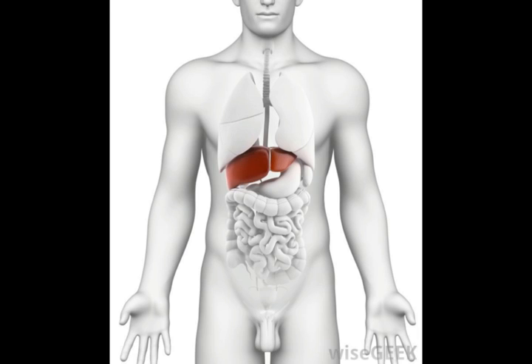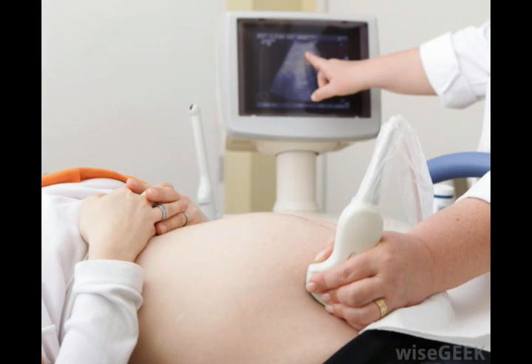One example of a hypoechoic mass, seen in the thyroid gland, is a benign tumor called a follicular adenoma. Confusingly, follicular adenomas may also appear hyperechoic, where more sound waves are reflected back, giving a brighter appearance. In either case, follicular adenomas seen on ultrasound scans tend to be surrounded by a ring which is hypoechoic. They are the most common kind of thyroid tumor, and they are often removed as a precaution because it can sometimes be difficult to distinguish them from thyroid cancer.